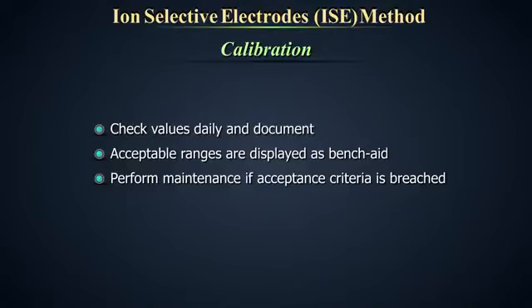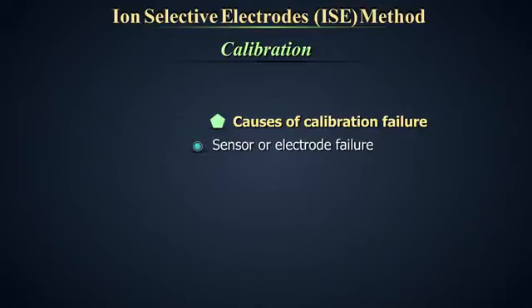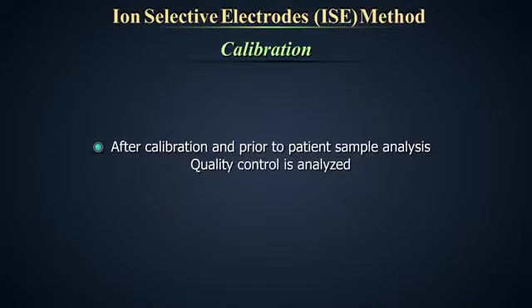If the acceptance criteria are breached, perform maintenance as per manufacturer's instructions. Few causes of calibration failure are sensor or electrode failure, reagent expiry, air bubbles in the probe. After calibration and prior to patient sample analysis, quality control must be analyzed to establish the equipment's performance.